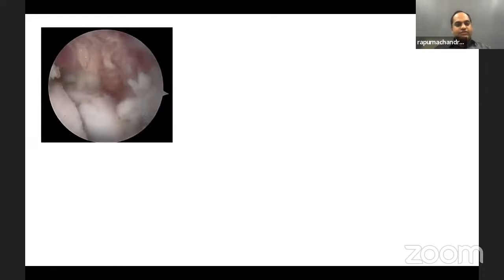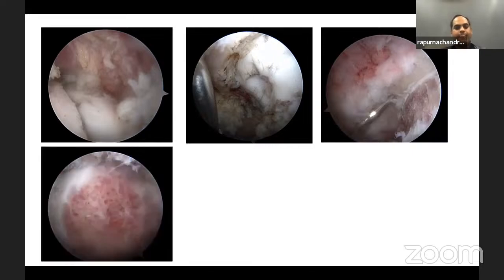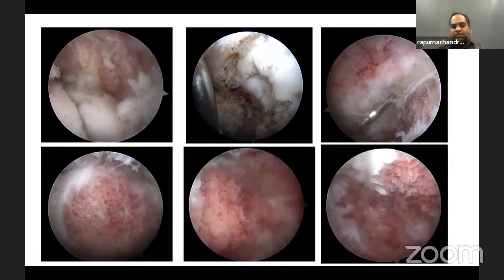And you can see in the first image, the right side is the femoral head, and this is the shelf of acetabular rim covering the femoral head. So you slowly go resect it. Of course, there will be some amount of iatrogenic damage, but luckily most of it is the impinging part. You slowly resect the head, you slowly resect the rim to gain an acceptable amount of good impingement free motion.